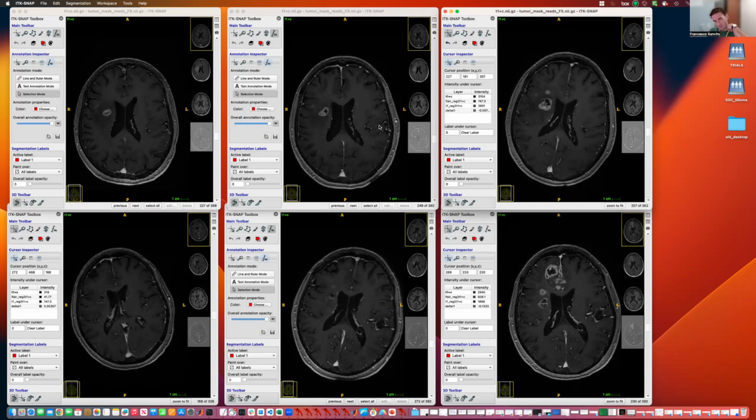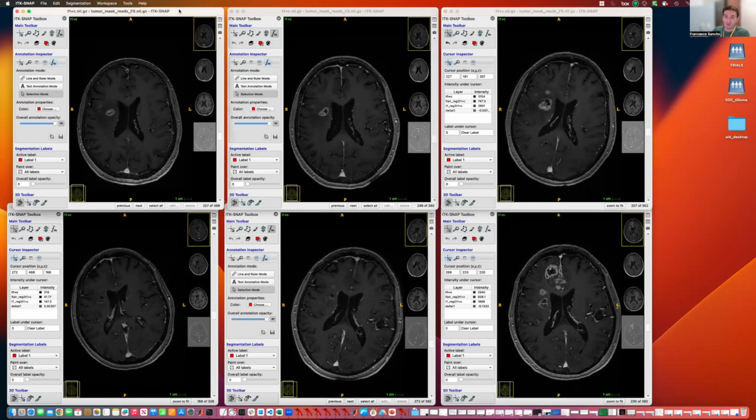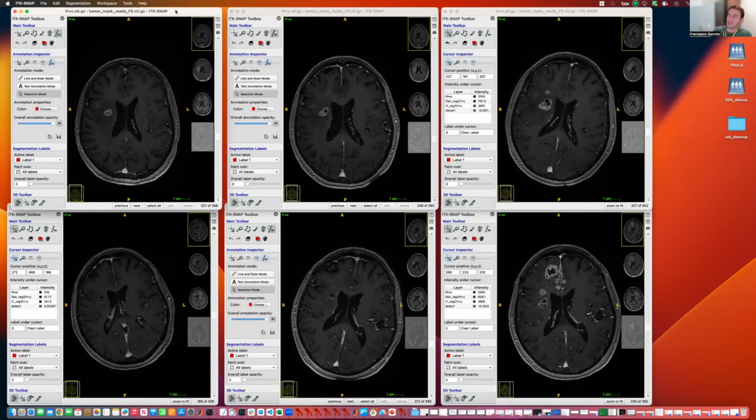In this study, patients were given immunotherapy, which is one of the situations where for RANO 2.0, it is advised to consider using confirmation scans. The use of confirmation scans means that when a lesion grows, you should wait for the next time point and demonstrate that it grew further in order to confirm that the lesion is actually in progression.